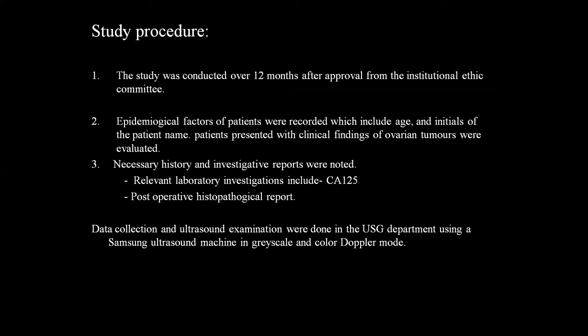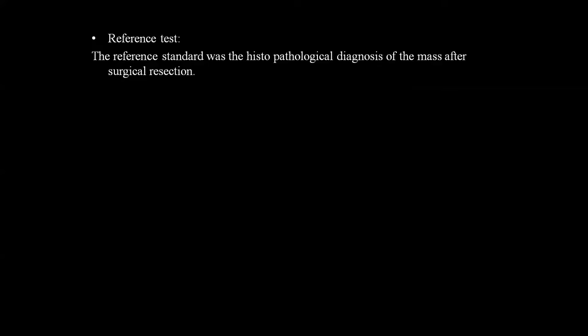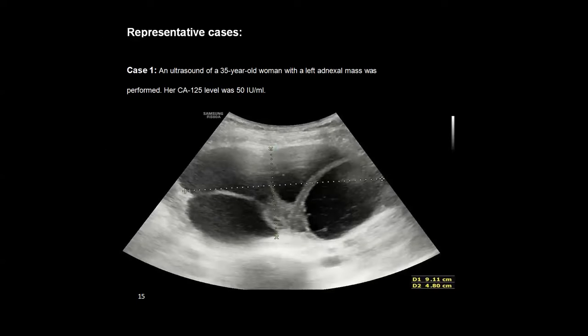The data collection and ultrasound examination were done in the USG department using a Samsung ultrasound machine in grayscale and color Doppler mode using a curvilinear and a transvaginal probe. Reference test: the reference standard was the histopathological diagnosis of the mass after surgical resection. Data analysis: the data was collected and compiled using Microsoft Excel 2019 and entered into SPSS version 26.0, and a p-value less than 0.05 was taken as the level of significance.